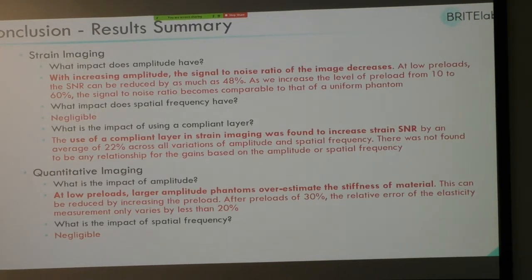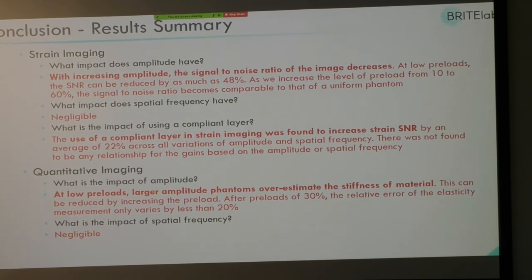So this is just summarizing the results. In strain imaging and quantitative imaging, the impact of amplitude is more significant than that of spatial frequency. And using a compliant layer for strain imaging does improve signal-noise ratio by about 22%.